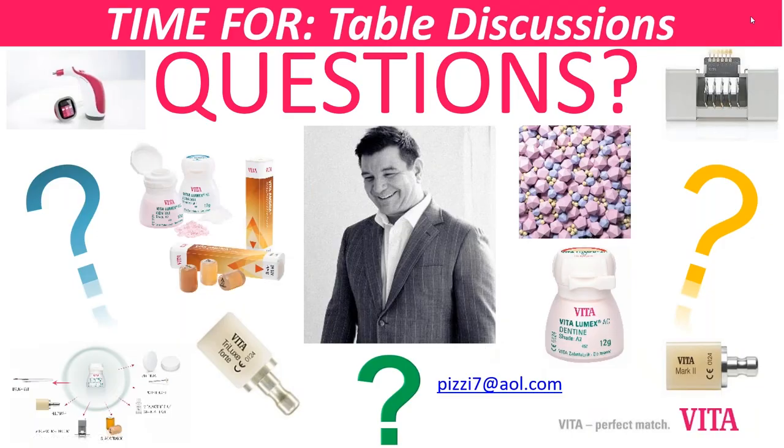A lot of times when we're doing the facial veneers, sometimes we're doing them because there's functional issues, meaning that the envelope is constricted, it's a little tight. And the last thing we want to do is have to start turning around on that tooth. We want to stay more on the facial. This way the tooth has the same functional capability. Once you start wrapping, you're kind of tightening the tooth, you're changing its frictional form. So in an ideal world, if it's a functional concern, staying as facial as you can is usually the best, unless the function is so problematic that you really have to go full coverage.